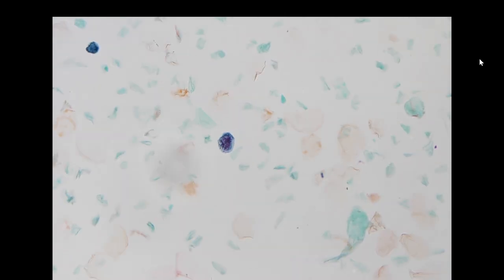We have squamous cell carcinoma that you saw, we have ruptured epidermoid cyst that you saw, only the degenerated keratinized plaque. And here we have individual squamous cells, mostly superficial, a little bit intermediate, but all of them were anucleated.